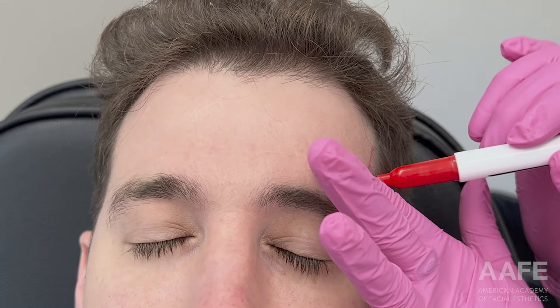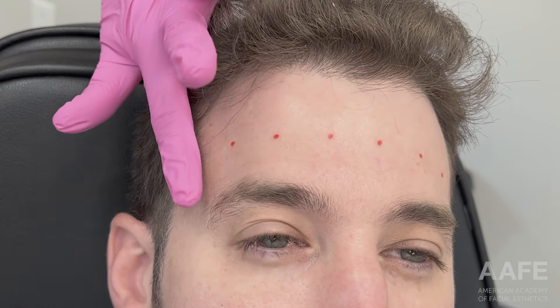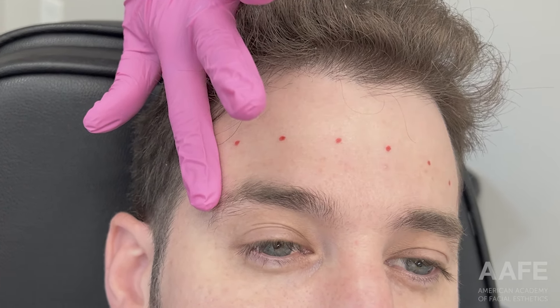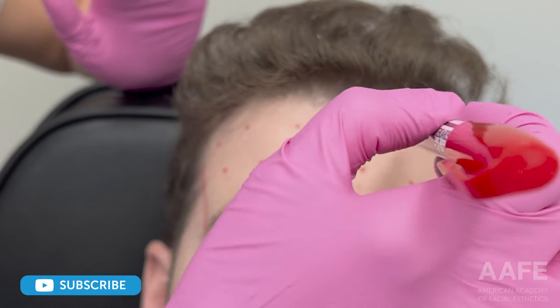Come along to do some tox — we are focusing on the upper face today. We're starting with the frontalis. I always have my patient raise their eyebrows so I can see the movement they have, and then I have them clench their teeth so I can feel that lateral border of the frontalis. From there I'm marking the lateral border.